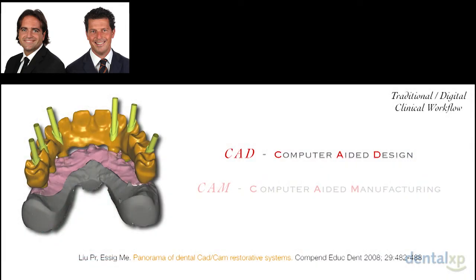So let's start our overview with simple definitions. What does exactly CAD/CAM mean? Thanks to the computer-aided design, a technician could design his own prosthetic framework.